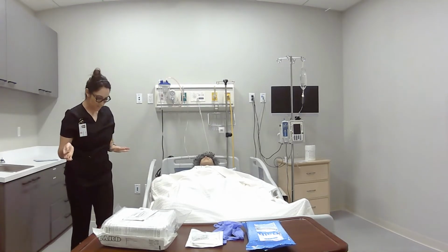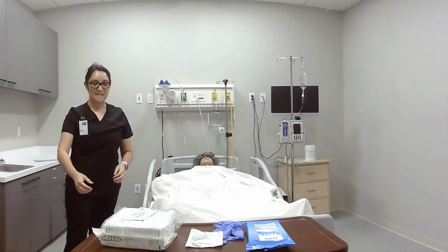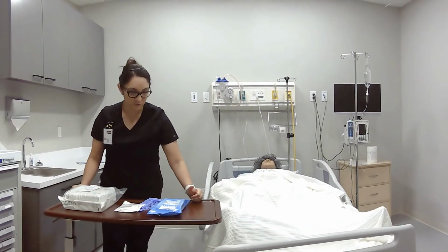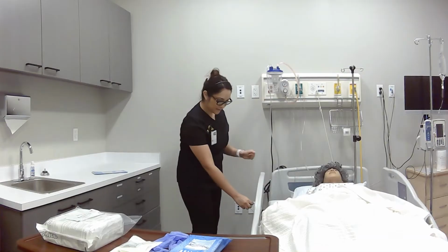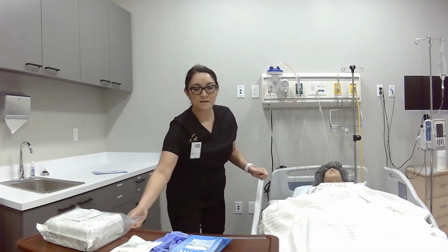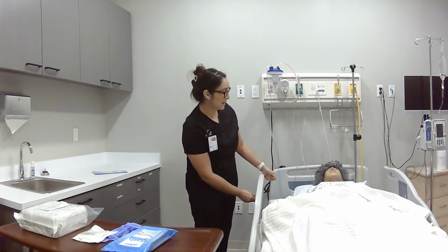Alright, so now that I'm on the patient's right side, make sure that your trash can is nearby, and you want to bring your table over with your supplies, okay? So we're going to bring the patient's bed up, because again, back safety is very important. Make sure your table is not going to hit the bed.